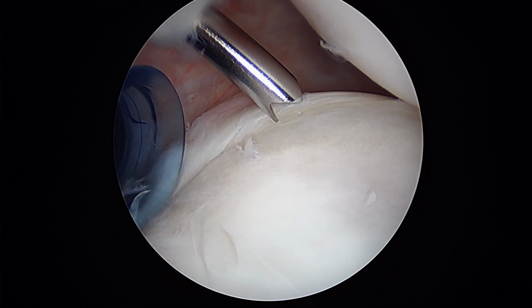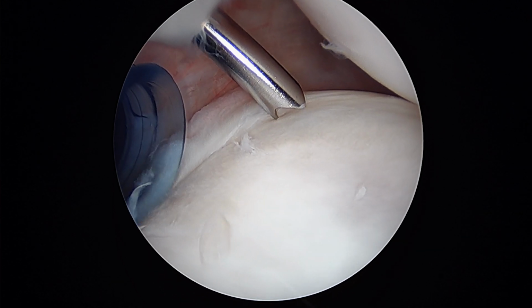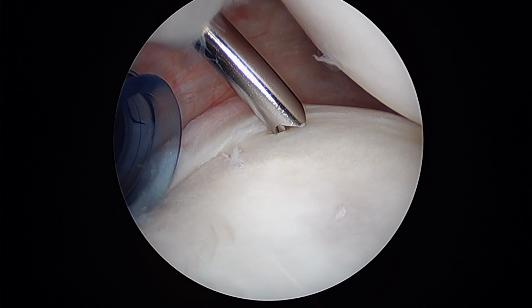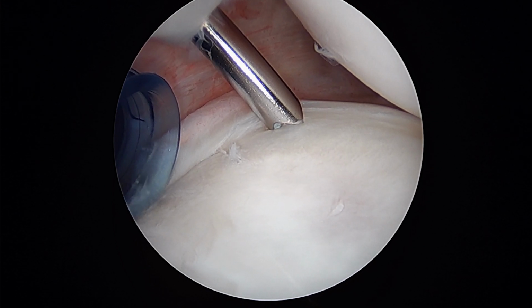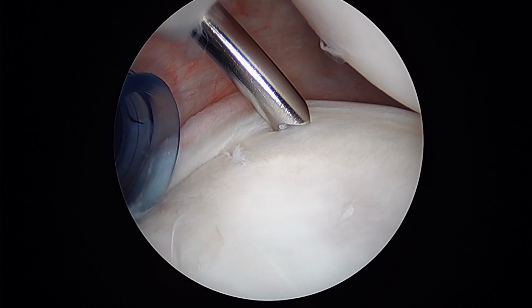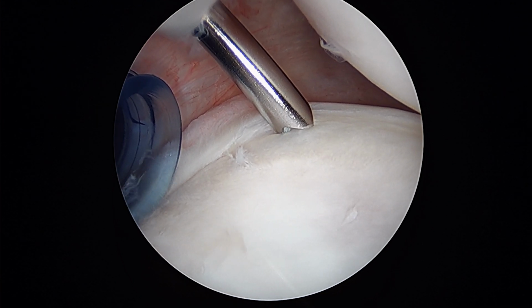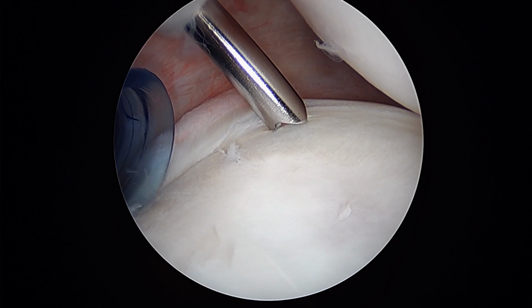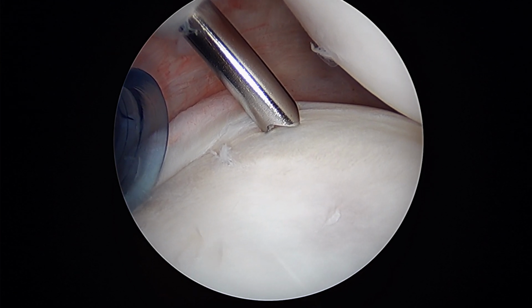Okay, so we're going to get our drill guide down right about here. And now we'll place our anchor right down in that same hole.